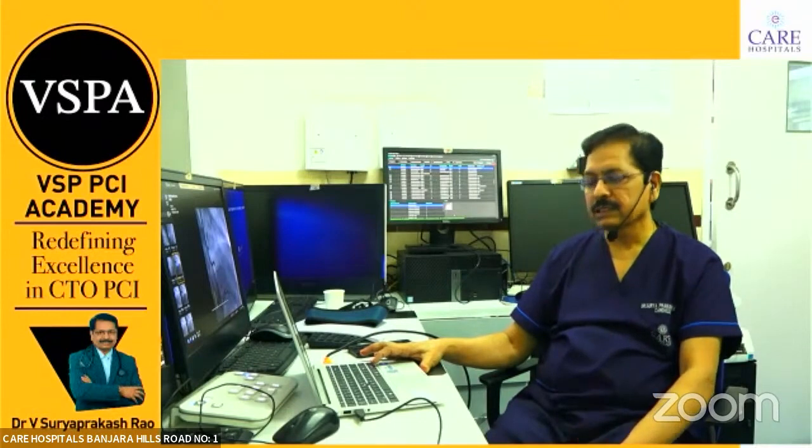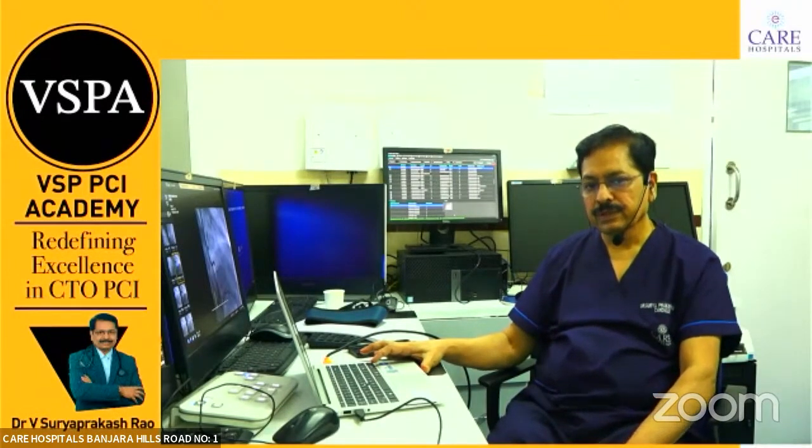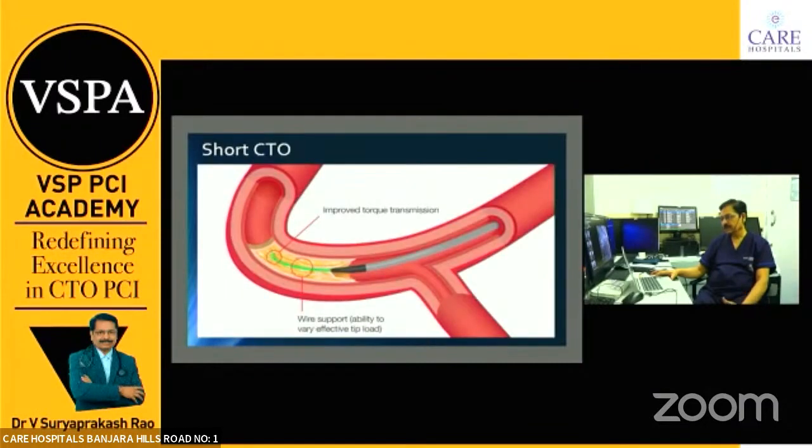And when the microcatheter reaches the distal site, then you have to penetrate the cap. There you need a tougher wire. Minimum 3 grams wire is ideal. Previously Miracle, but nowadays the Gaia wires have taken over, Gaia, Gaia Next. And then the ultimate penetrating wires, the Gladius Mongo wire. These are excellent wires which can penetrate the distal caps. So you have to have the wire crossing, and along the wire crossing, then your microcatheter also goes.